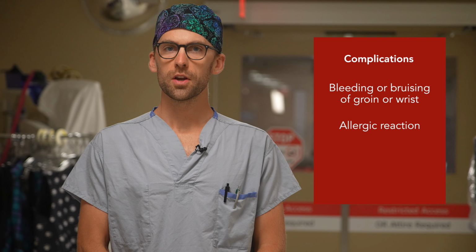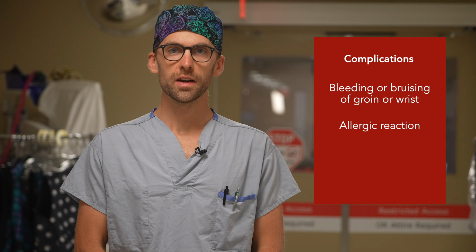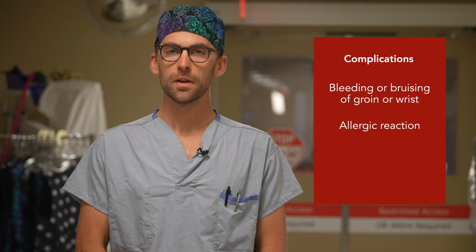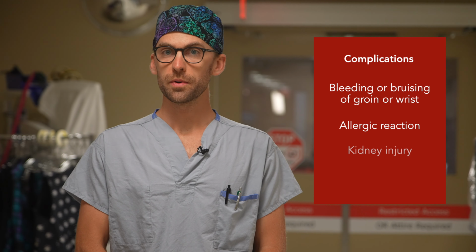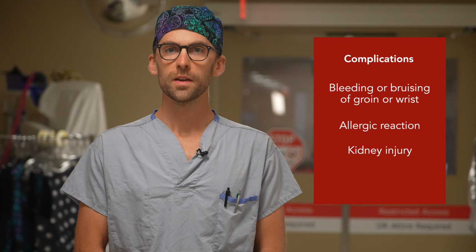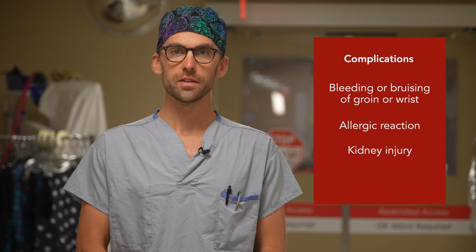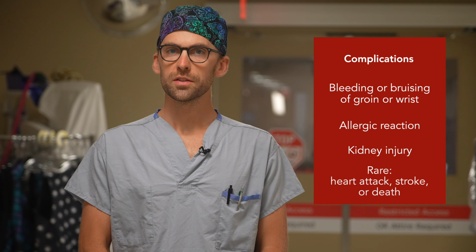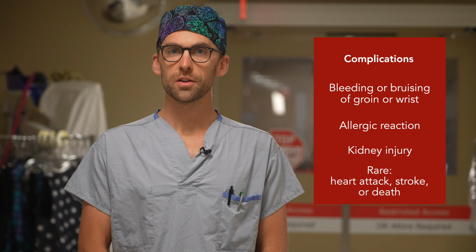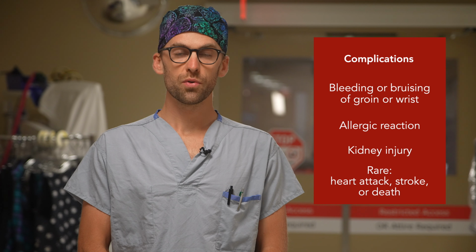An allergic reaction to the contrast can also occur. It is important to notify the cath lab staff if you have a history of allergic reactions to contrast, commonly known as IV dye or iodine. Occasionally, contrast dye can interfere with kidney function, particularly in patients who already have impairment in kidney function. The cath lab staff are experienced with these complications and ready to act and treat you should these occur. More rare complications of an angiogram can include heart attack, stroke, or death. These complications are extremely rare, and your cardiologist can provide you with information for your own risk prior to your procedure.